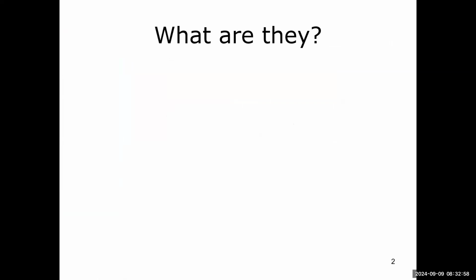SID, KV, speed, MA, and time. So KVP, MA, time, SID, or the combination of MA and time together as mAs. So a lot of your machines, you're just going to set mAs.